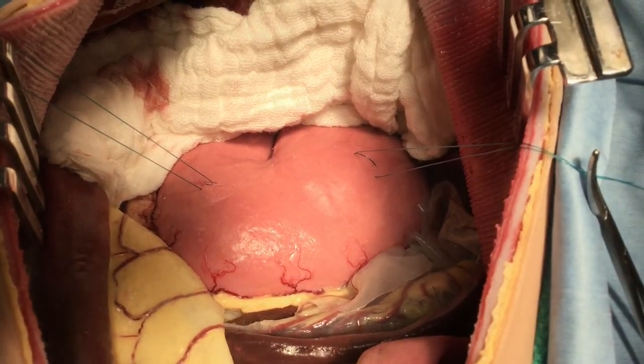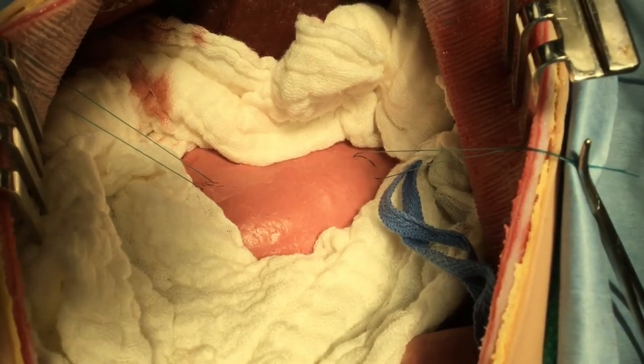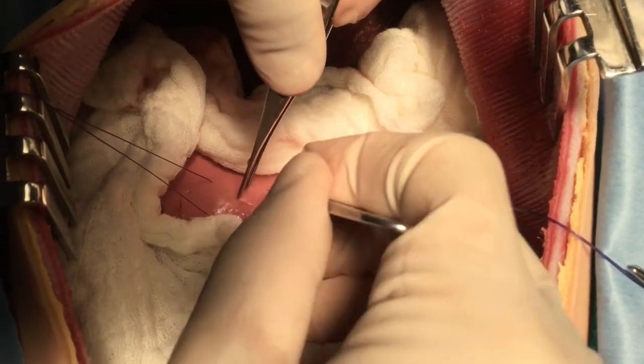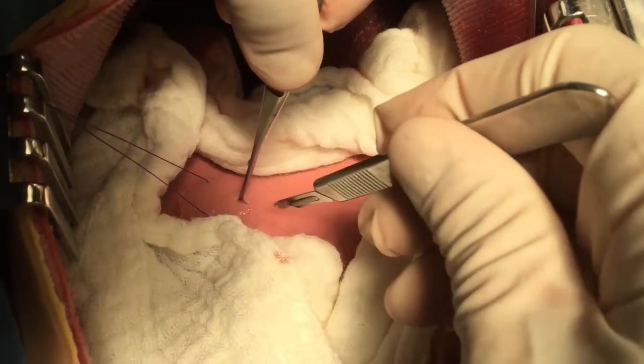Then, laparotomy pads are packed around the stomach to minimize any contamination within the peritoneal cavity.